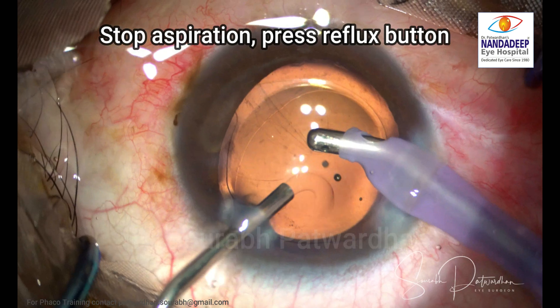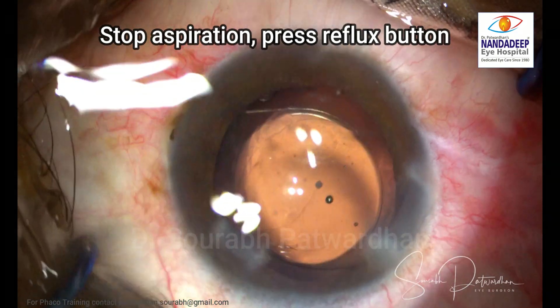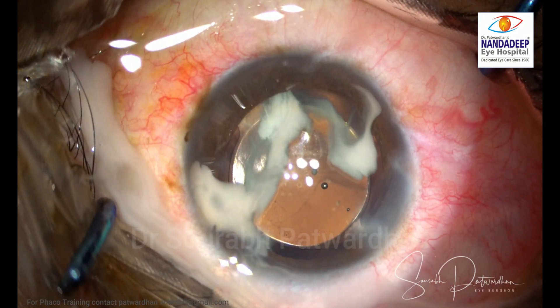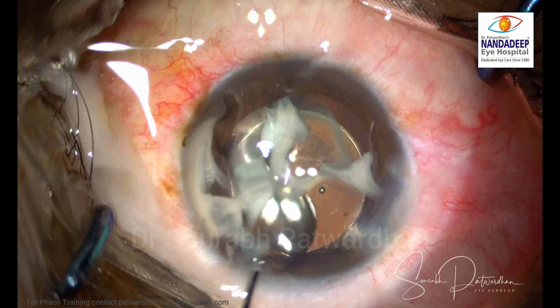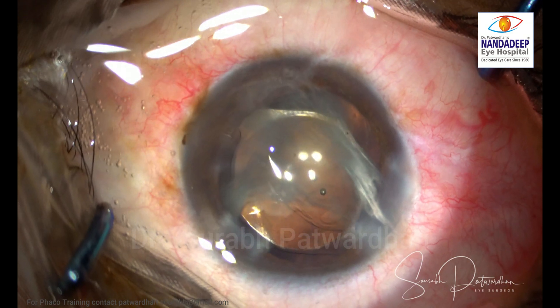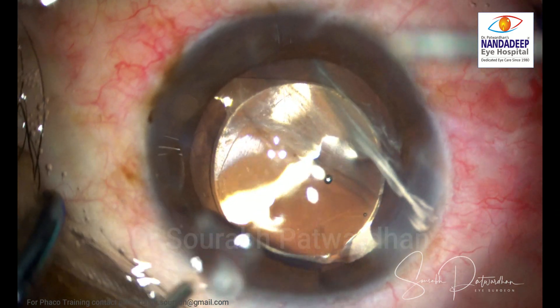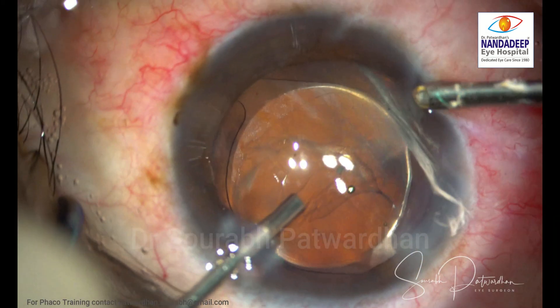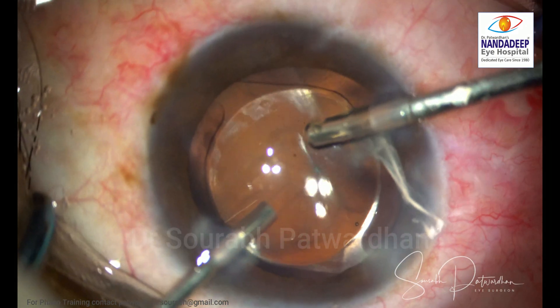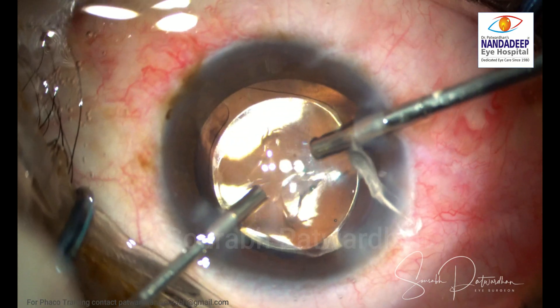The next procedure is to remove this vitreous from the anterior chamber. It is important to delineate the vitreous using triamcinolone — just a little bit, you can dilute it. You can see the vitreous started prolapsing further as I hydrated, so I am going to use the anterior vitrectomy probe.